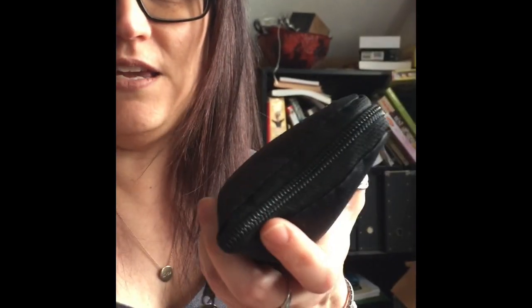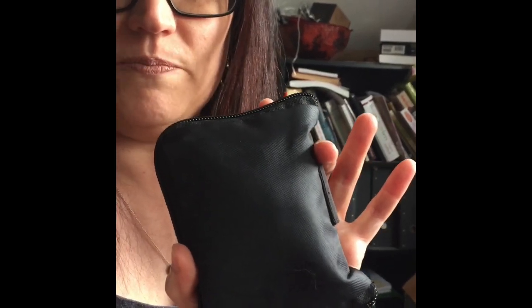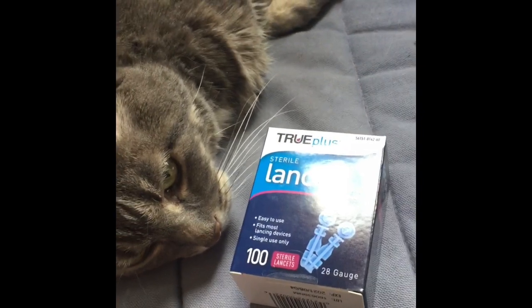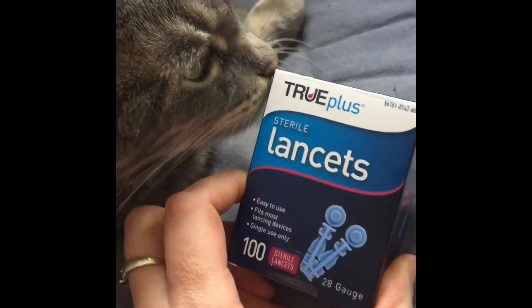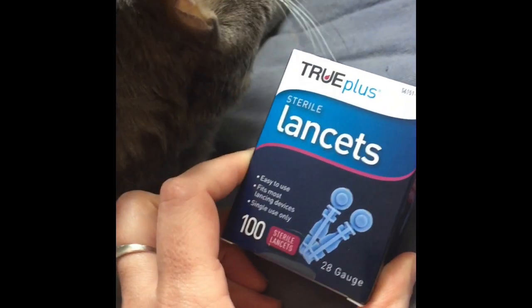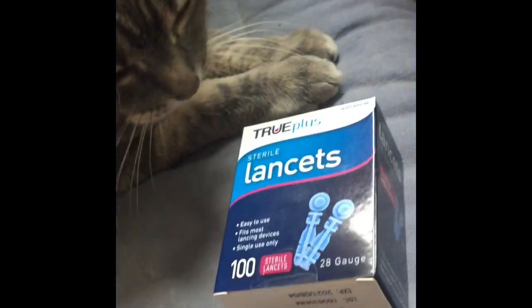So first I want to show you what's in my testing kit. This is my testing kit and it's got my meter and all the supplies that I need for testing my cat Cece. So these are the lancets that I use. They are really cheap — I buy them online for about $1.19 for a hundred of them. You don't need the lancing device at all. Just the lancets are fine.